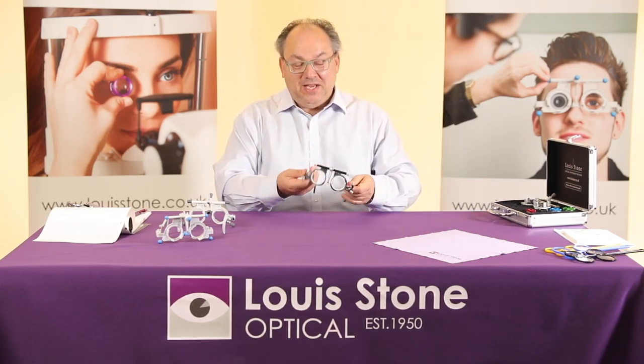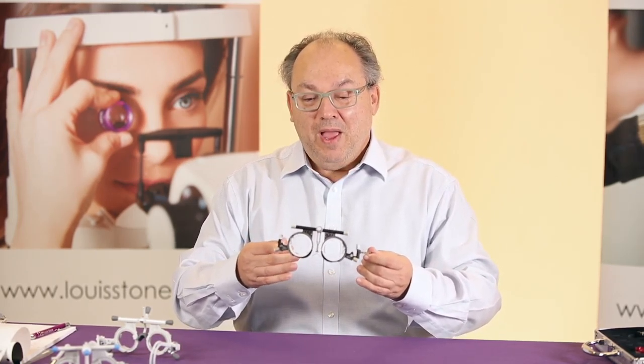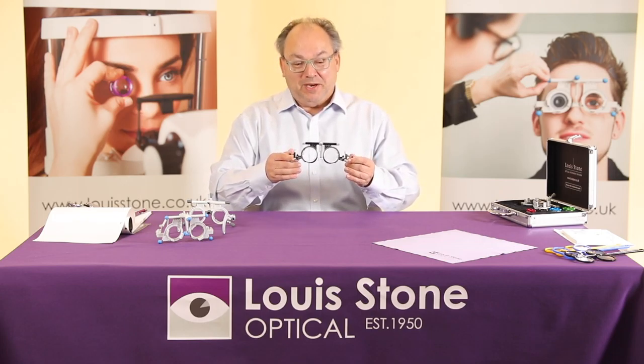Finally, the third trial frame — this is the UB3+, which used to be the UB3. This was always known as the traditional frame. Many of your parents would have worn this at the opticians many years ago.